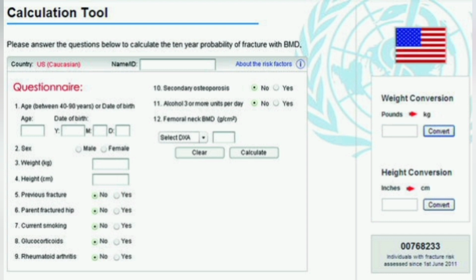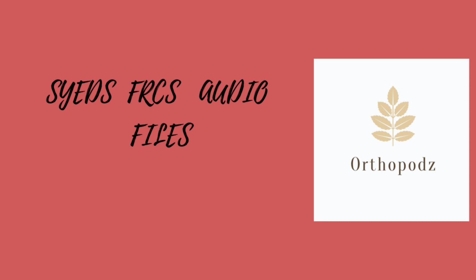Advantages: calculating osteoporosis risk, calculating BMD. Disadvantages: ionizing radiation, a form of X-ray, and it requires precautions: time, distance, and shielding.